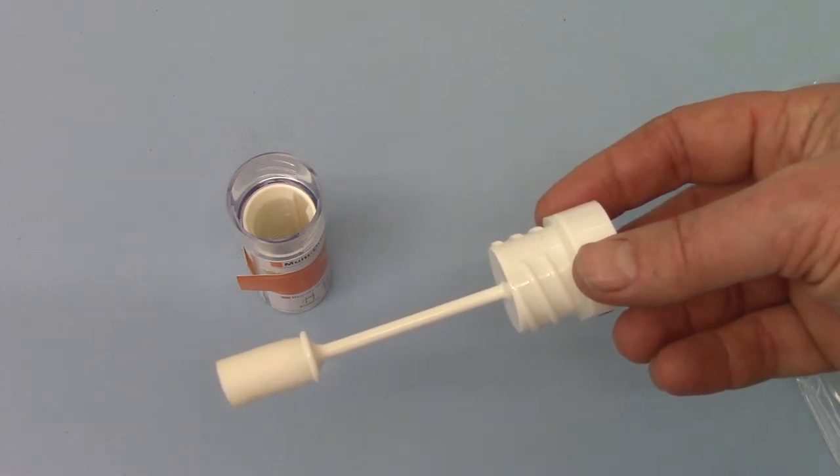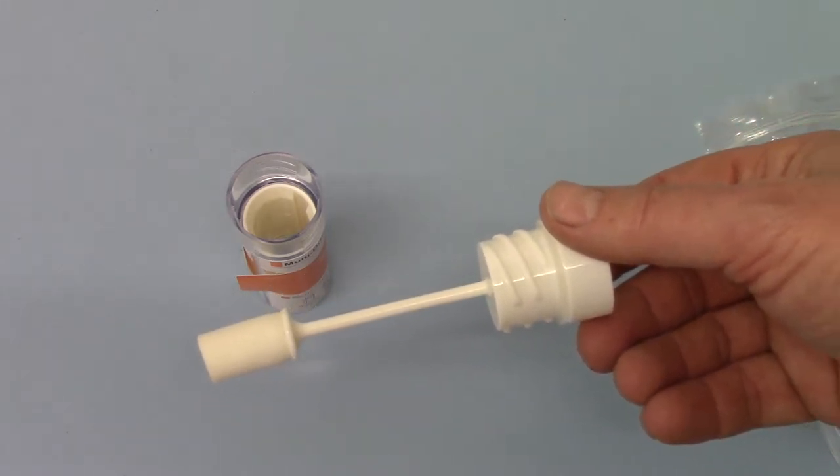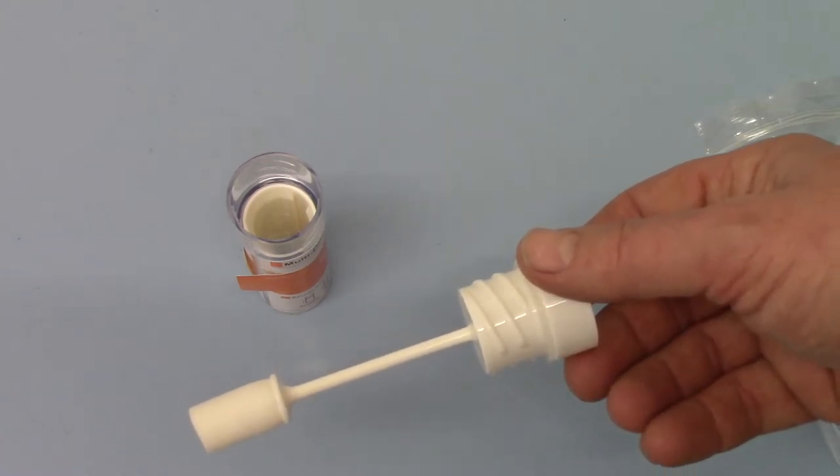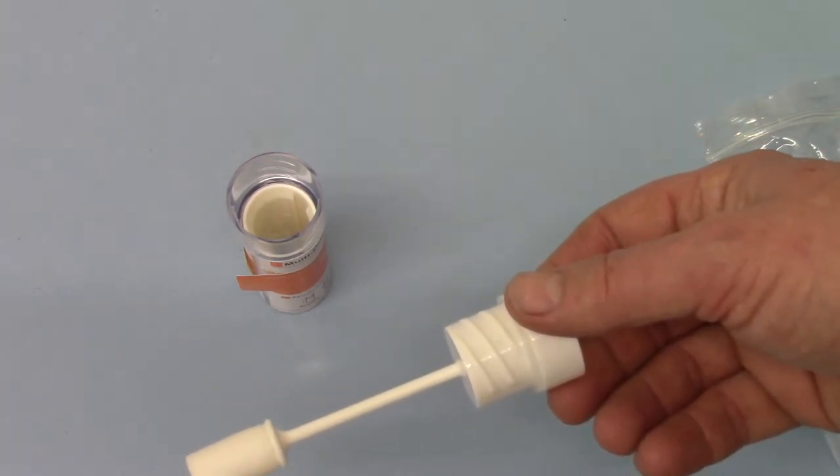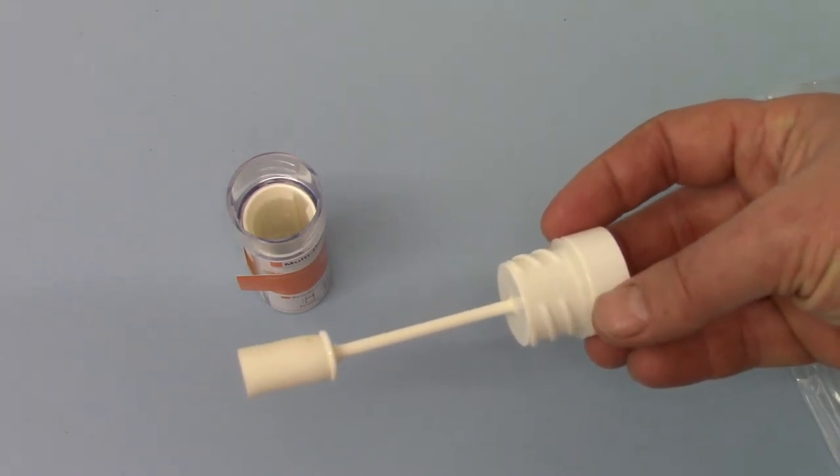It isn't a simple swab around the dry mouth to absorb enough saliva. This does have to be completely saturated, and you do need partial cooperation of the person you're taking the sample off to work the saliva in the mouth onto the swab and saturate it fully.